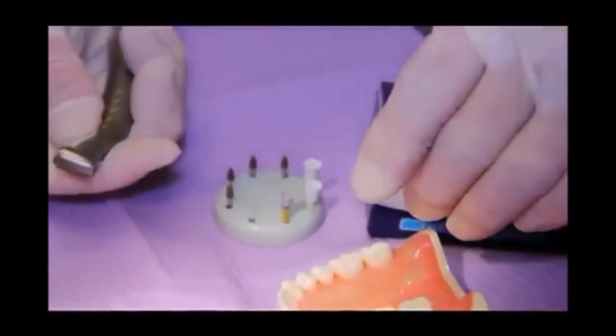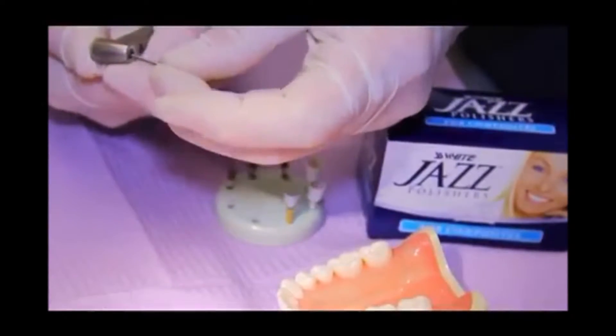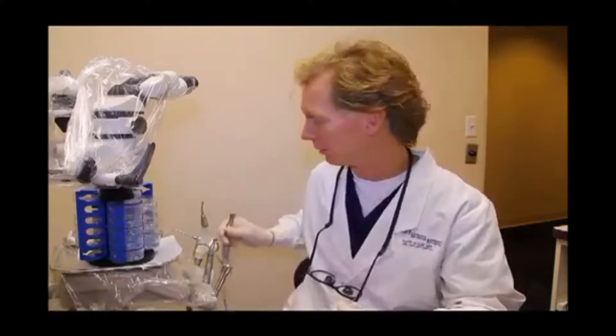We move to finishing, to polishing, and it's a little bit interesting as far as the sequence. The first thing we're going to do as far as margination and creation of mamelon grooves — that create beautiful natural light reflection — is a brownie. We're going to use a traditional brownie, these are about a buck. With an electric handpiece, we change it from 40,000 down to about 12,000 RPMs — I really have two settings, fast and medium. They have a lot of torque and that way the brownie doesn't explode. If you run these in your air-driven handpiece, that's okay, but remember if you run them at full speed they'll explode and create a lot of heat.